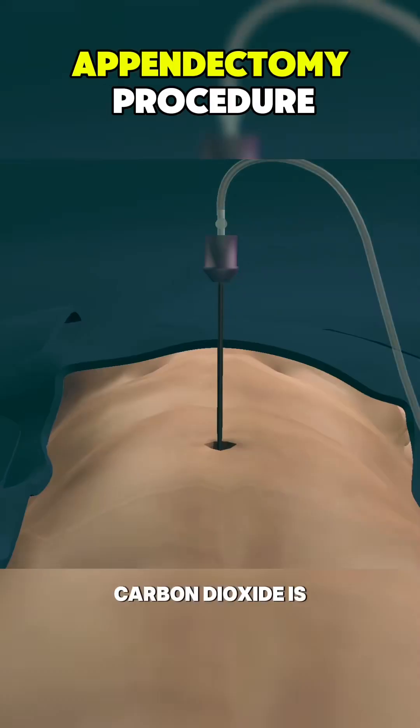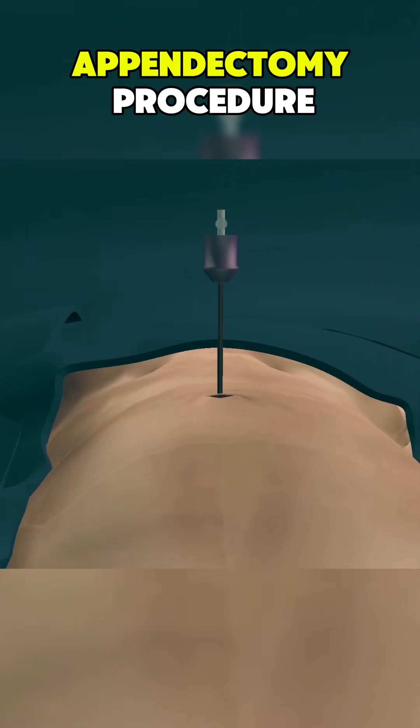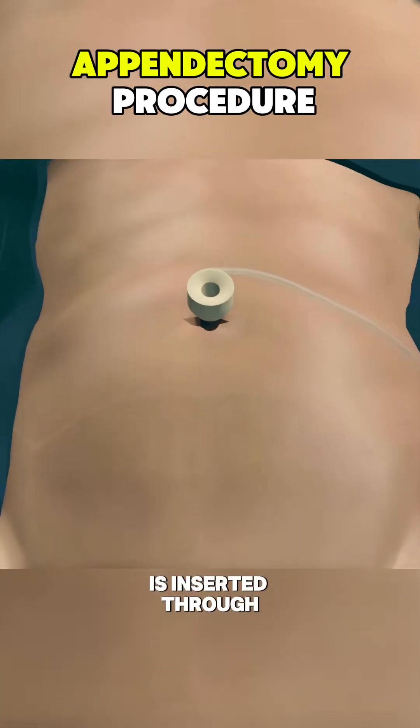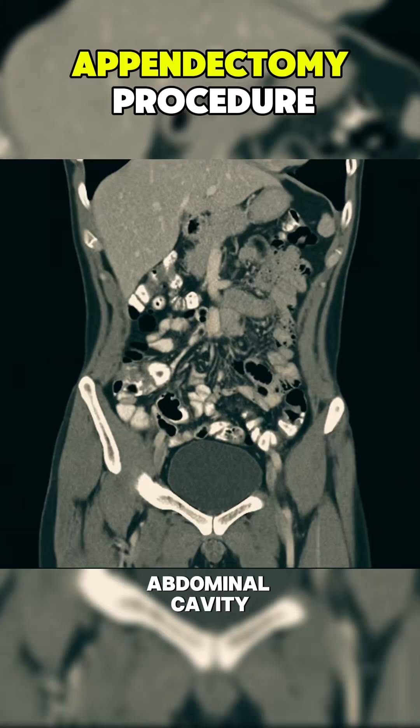Carbon dioxide is pumped in to inflate the abdominal cavity, creating better visibility. A laparoscope, equipped with a camera, is inserted through one of the ports, allowing the surgeon to view the abdominal cavity on a monitor.